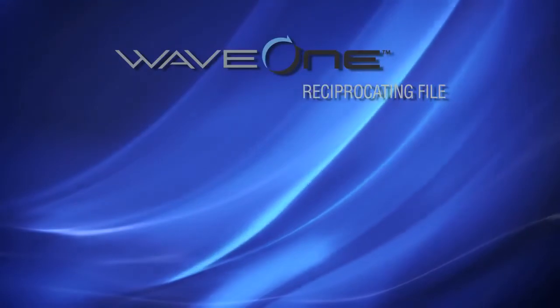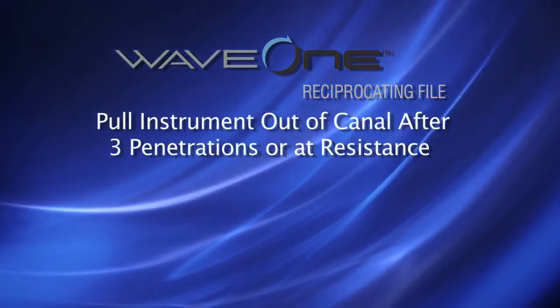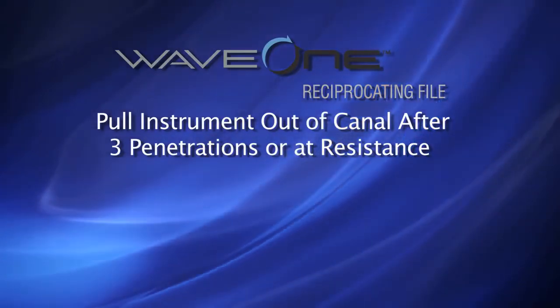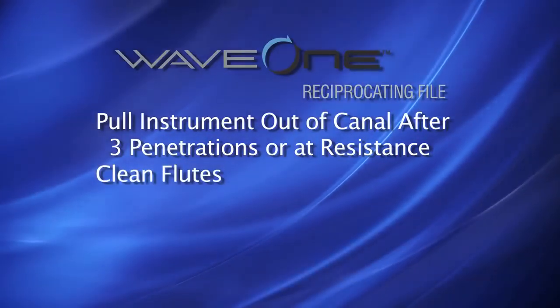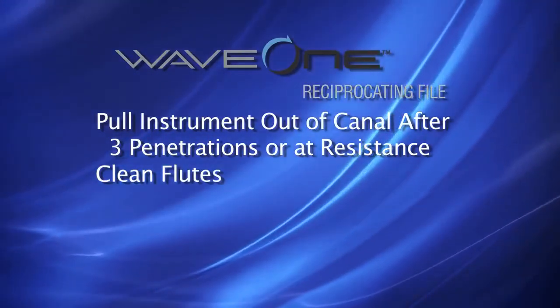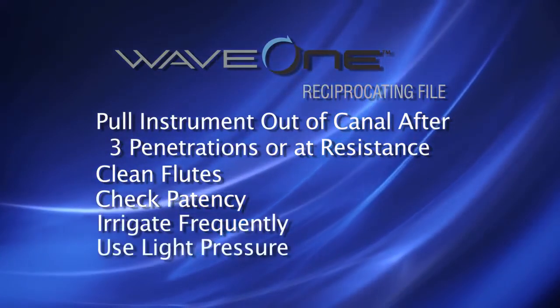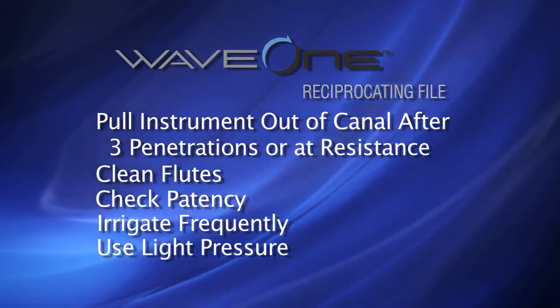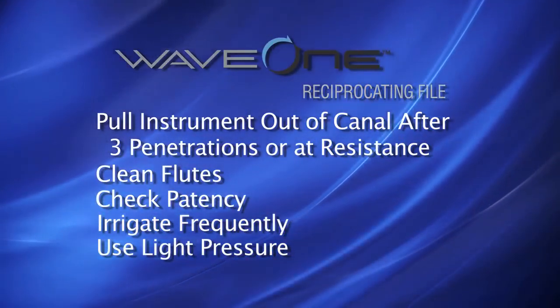There are a few key points to remember with the Wave 1 technique. First, pull the instrument out of the canal after 3 in-and-out movements or when resistance is encountered. Clean the flutes of the instrument and regularly check canal patency each time you irrigate. Do not apply excessive pressure if resistance is encountered. Instead, pull the instrument out, clean the flutes, check canal patency, and irrigate.